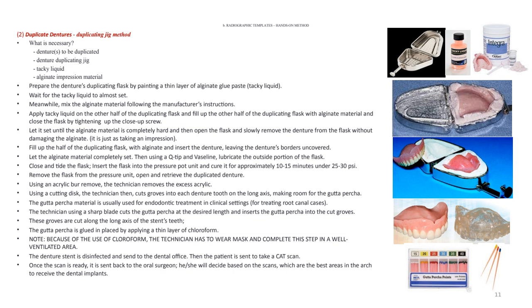The gutta-percha points are used for root canal treatment, and they have a property that they can be seen through X-rays or scan.